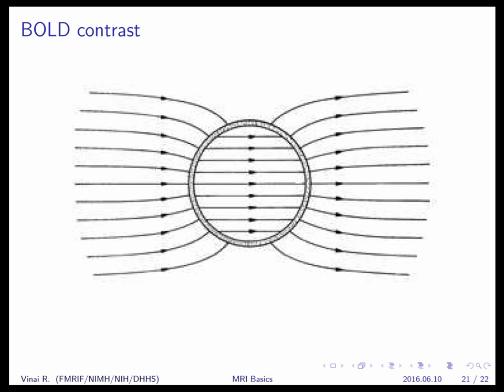Why this is important is because, if you have a region of brain which is not active or not so active, there's some deoxyhemoglobin in the vasculature around the capillary bed, venules, and it turns out that there's enough of a gradient here. So the difference between the magnetic field inside the blood vessel versus in the tissue, so there's a magnetic field from high to low, and the gradient around the vessel causes the protons in this area to decay away faster because of this background gradient. So this is this T2 star effect that I was hinting at earlier.